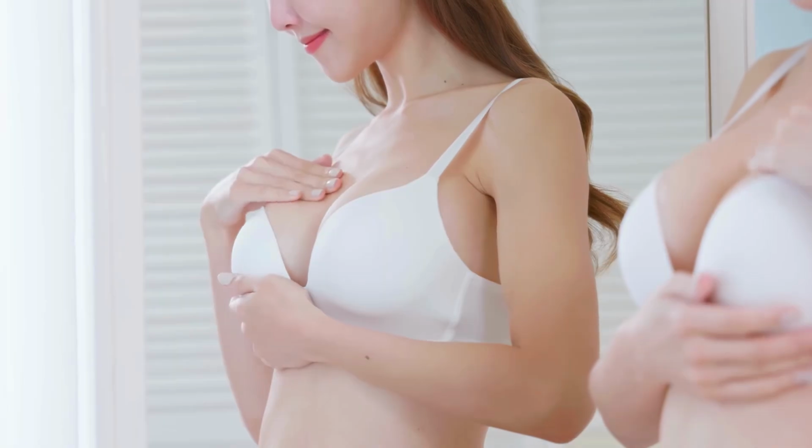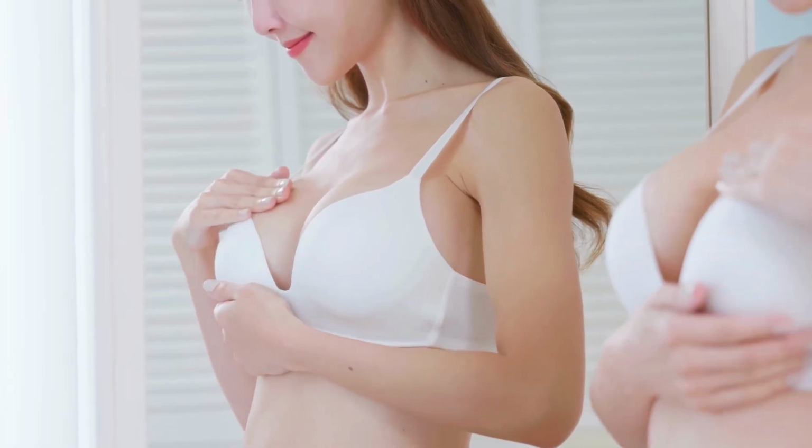This is a great approach because it's still technically not exposing your implant to any bacteria which are in your breast tissue, but we still have that nice soft feel. And also patients definitely have quicker recovery because remember, we're not stretching out the muscle, it doesn't hurt as much. Stretching out the fascia actually has little to no pain after surgery. So this is why I love that approach.